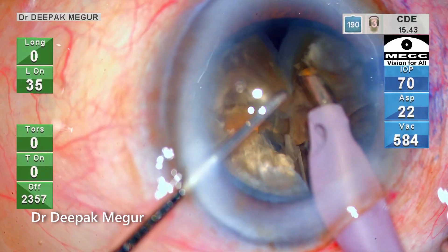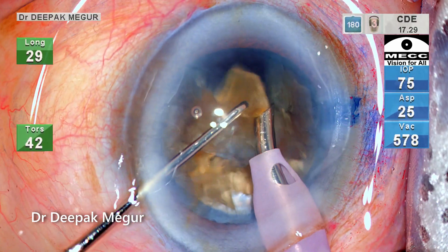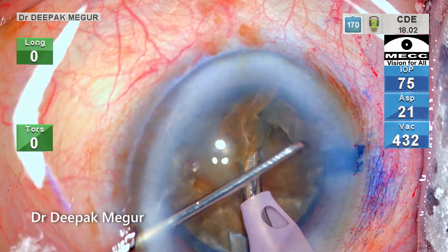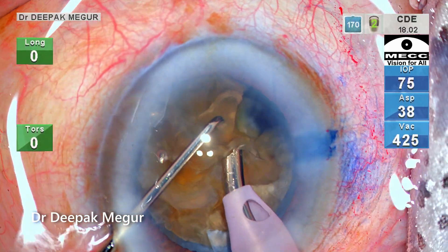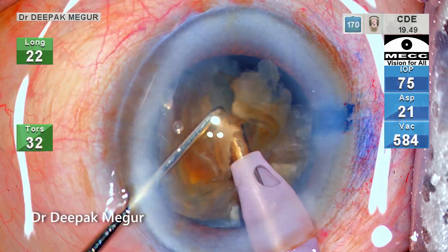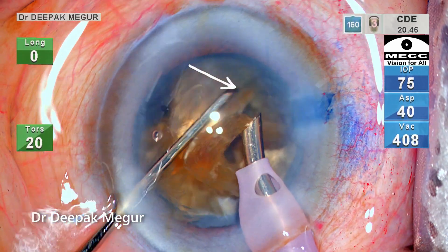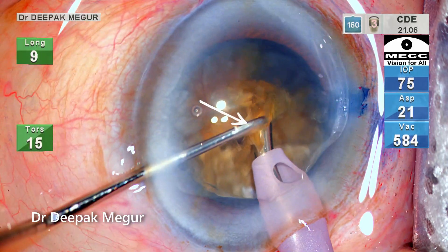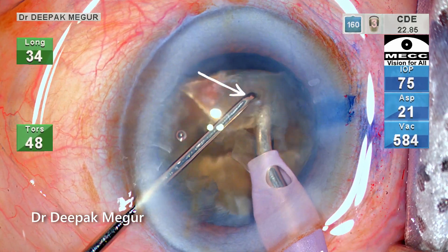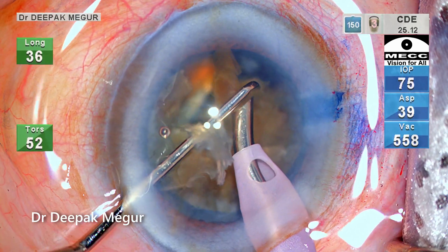The nucleus is divided into smaller fragments and now is the time to emulsify them. As the first piece is being emulsified, the second piece also escapes out of the bag — this is something unwanted. Ideally I would want only one piece out of the bag so that management is more controlled. When a second piece jumps out, which usually happens if the rhexis is bigger, there is a chance of it touching the endothelium. So I am using my chopper to prevent the pieces from coming anteriorly and hitting the endothelium.